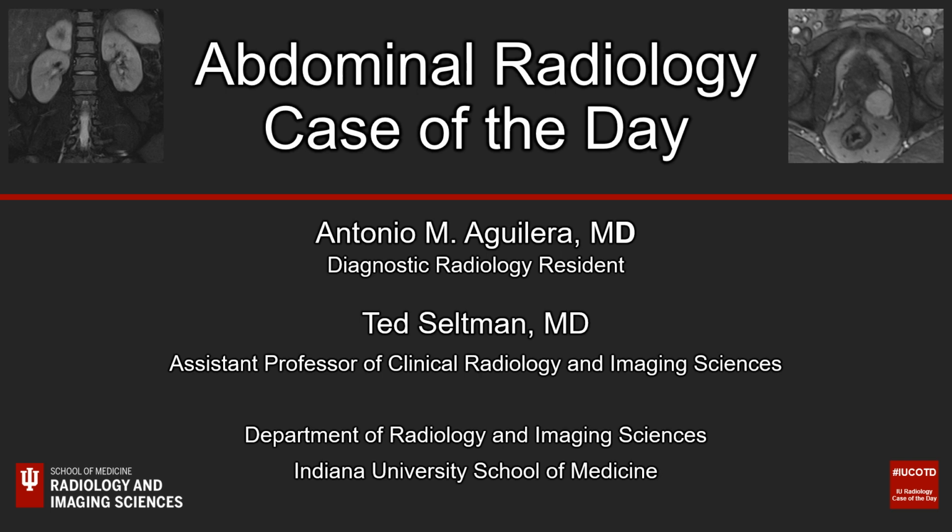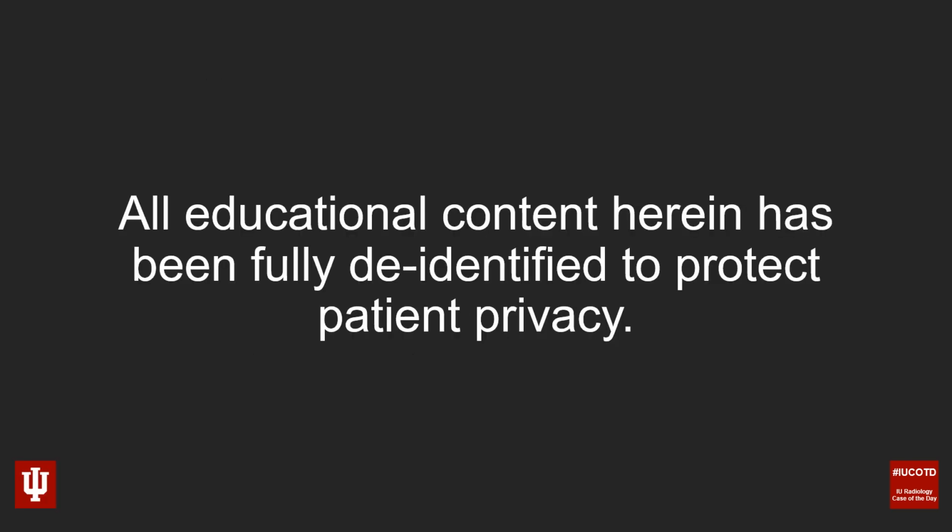This is another edition of IU Case of the Day, and we're going to be talking about an abdomen case. My name is Antonio Aguilera, and I am a PGY5 radiology resident, and my staff helping me on this case is Ted Seltman, who is an assistant professor in the body department. All educational content herein has been fully de-identified to protect patient privacy.